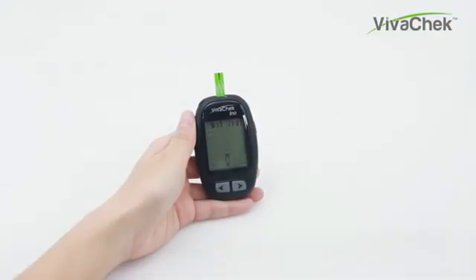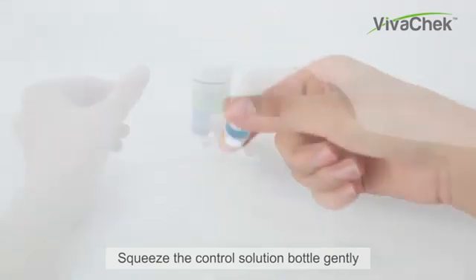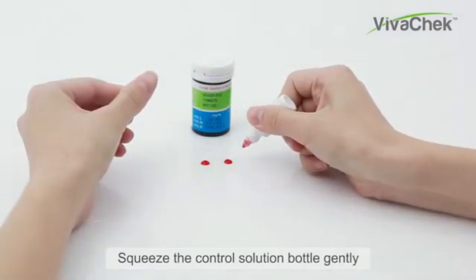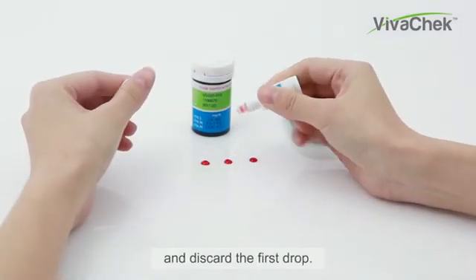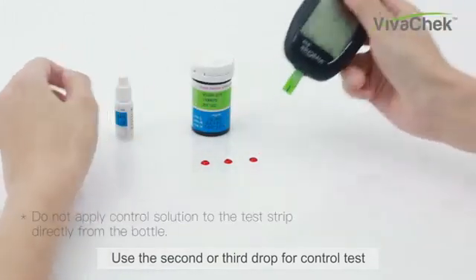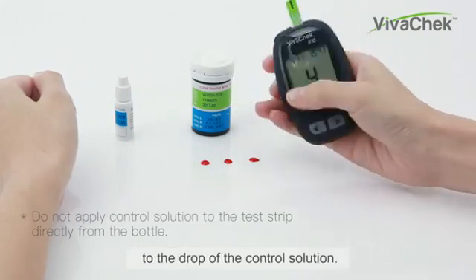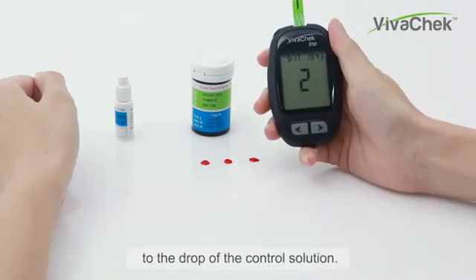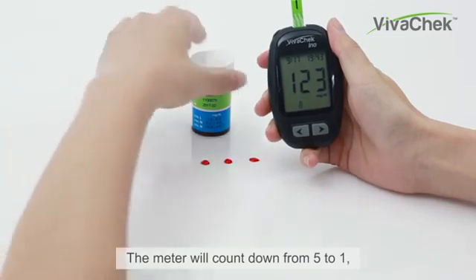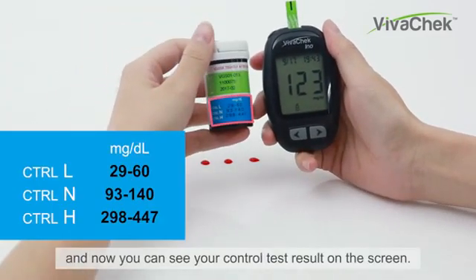Shake the control solution bottle thoroughly. Squeeze the control solution bottle gently and discard the first drop. Use the second drop of control solution for the test. Immediately touch the tip of the test strip to the drop of control solution. The meter will count down from 5 to 1, and now you can see your control test result on the screen.